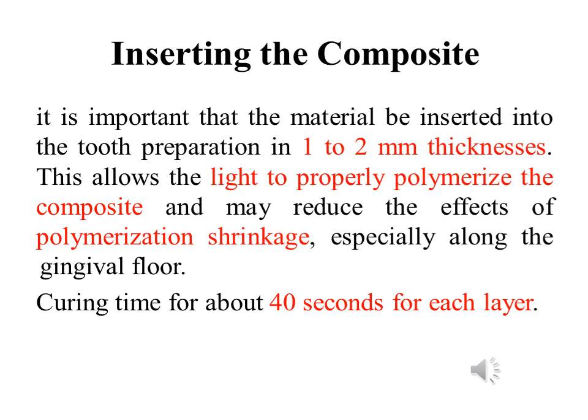Additional light cure may be used when we have class 2 or class 4 cavity preparation to the proximal area after we remove the celluloid strip or celluloid band.